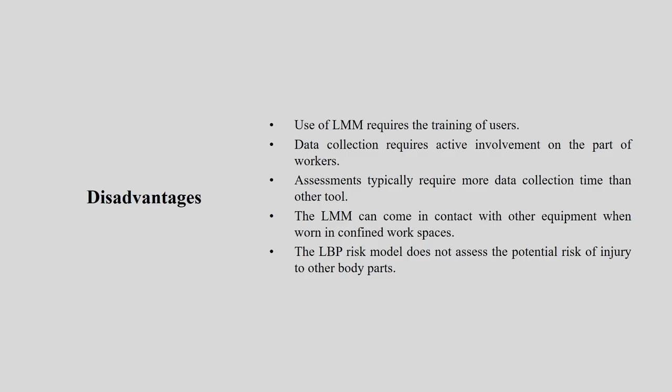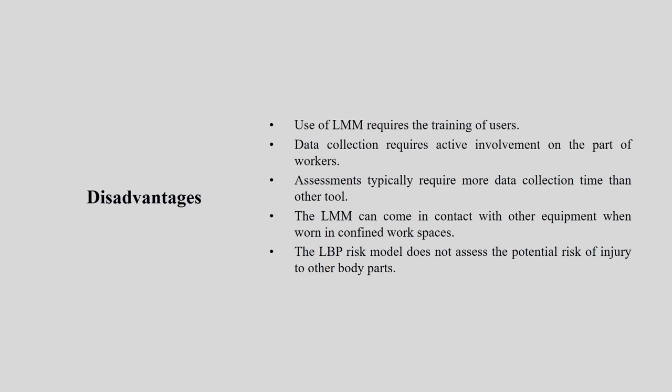But there are some disadvantages. For every tool, there will be some advantages and some disadvantages. Based on your objective, you have to choose which one is useful for you and which one is not. So, use of LMM requires training. You can understand it's a complicated instrument. It needs understanding of the software, of the hardware, and of how to integrate them. So it needs a lot of training.